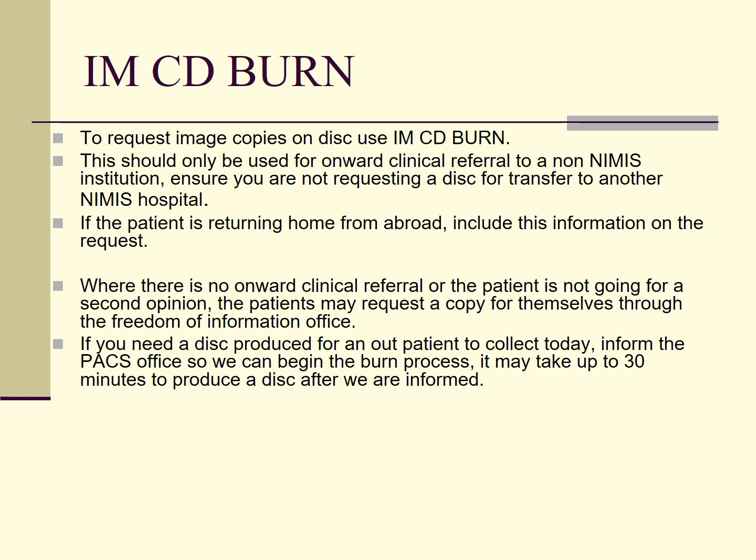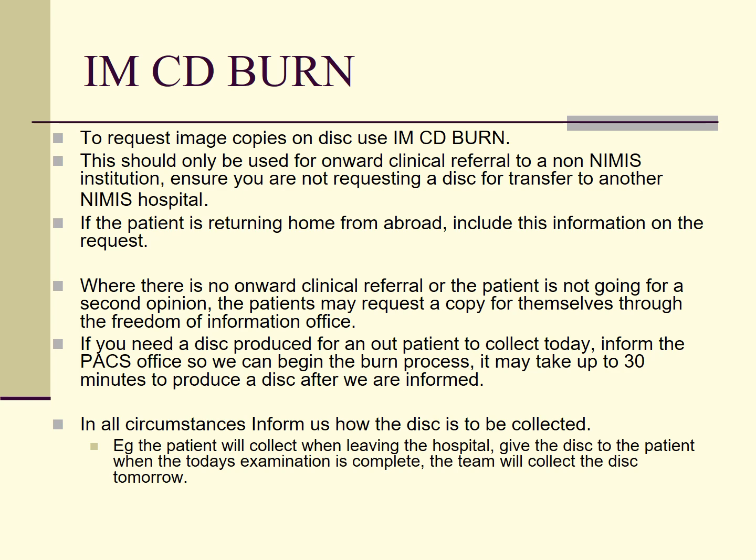If you need a disc produced for an outpatient to collect today, inform the PACS office so we can begin the burn process. It may take up to 30 minutes to produce a disc after we are informed. In all circumstances, inform us how the disc is to be collected, e.g. the patient will collect when leaving the hospital, or give the disc to the patient when today's examination is complete. The team will collect the disc tomorrow.